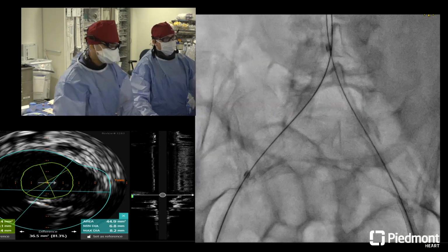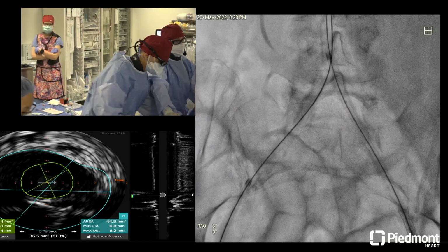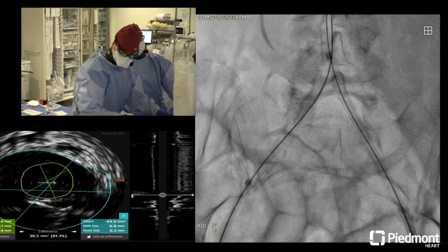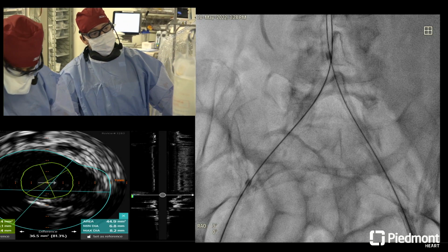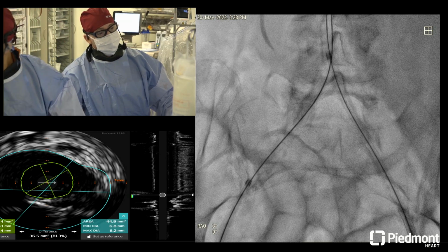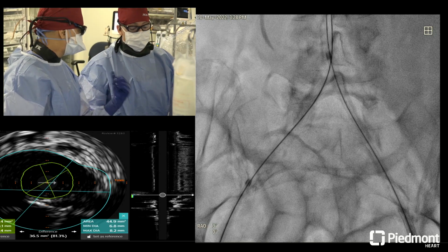And I think it was Vikas who said, it depends upon what it looks like now that it's been treated, in terms of using self-expanding. I'm probably going to use some self-expanding stents down there. That area down on the left, as you should see, that stent's been a little bit underexpanded. We may need to use some shockwave there or not. I don't know what you guys' thoughts are on underexpanded stents in the iliac. Yeah, BJ.